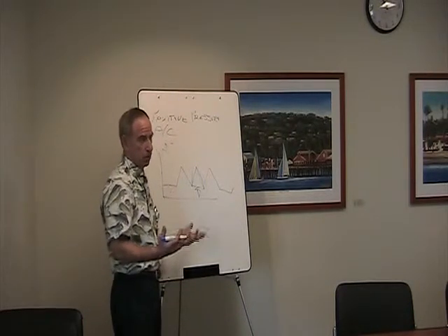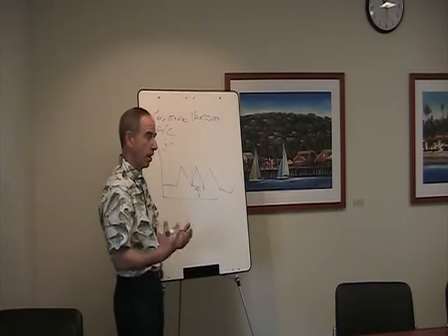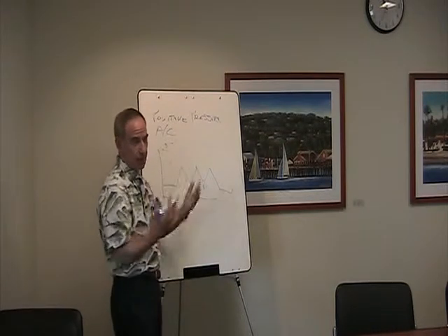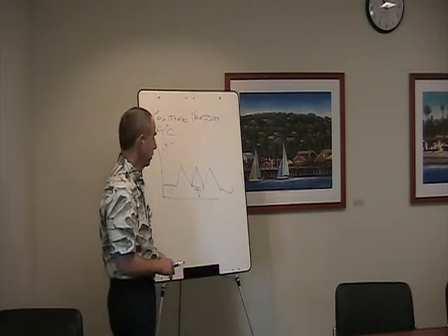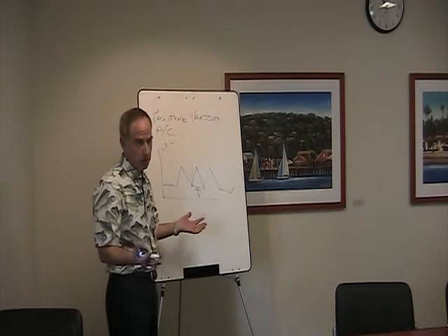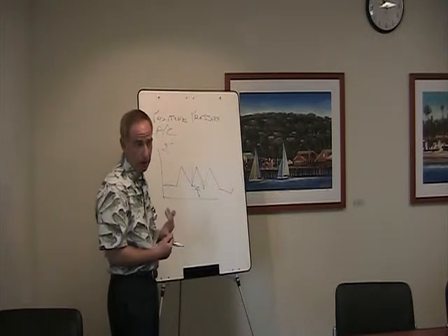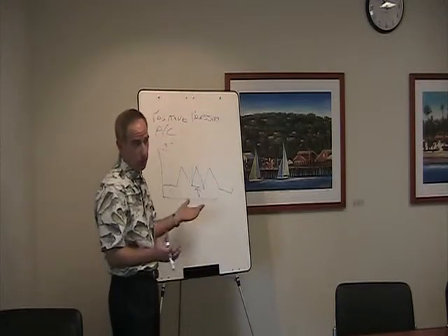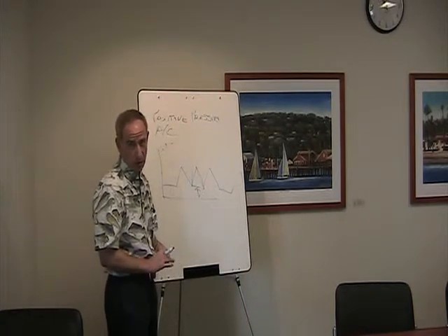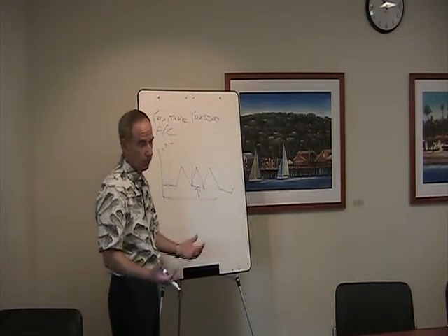So if their PCO2 is going, or if their pH is going down and they feel like they need to breathe faster to compensate for that, they can now do that. Under CMV, they can't do it because they don't get any air when they breathe. Okay? So we don't use CMV anymore. Nobody uses it. The only time patients are in CMV effectively is when you have somebody that's either so sedated they're not breathing on their own, or they're paralyzed. Then no matter what mode you have them in, effectively they're in CMV. You're controlling all of their ventilation. Okay, they have no control over it. But there's not actually a setting for CMV.